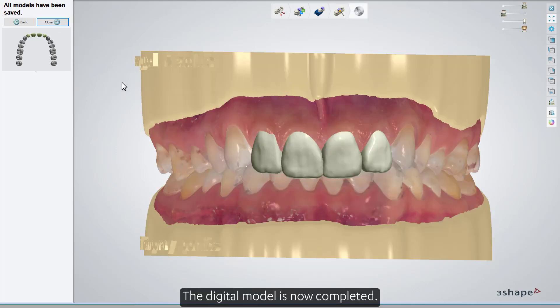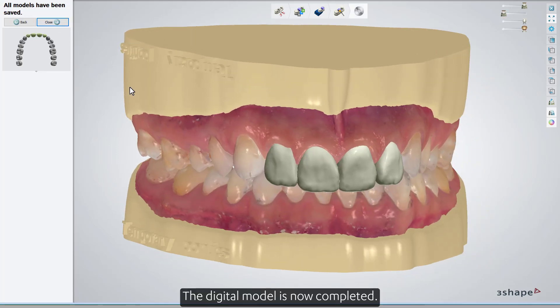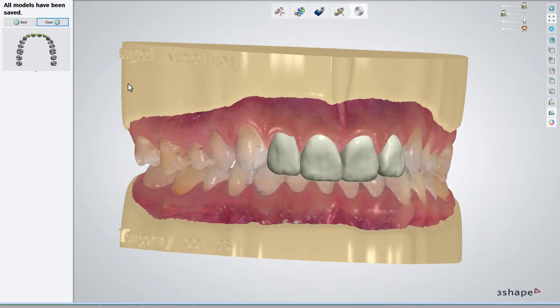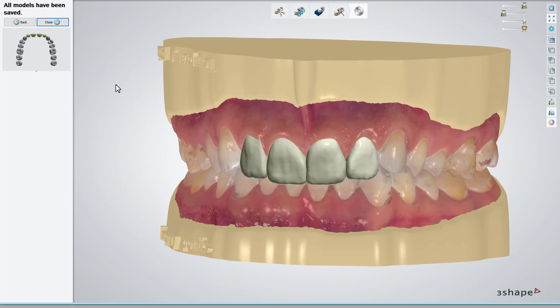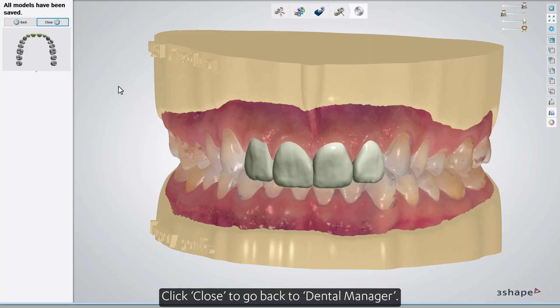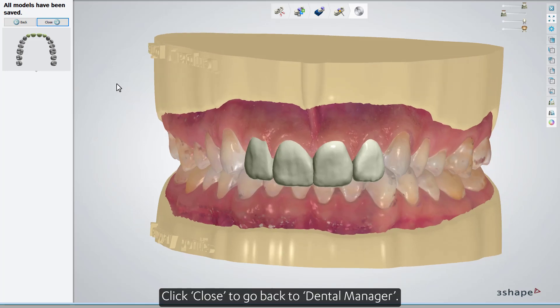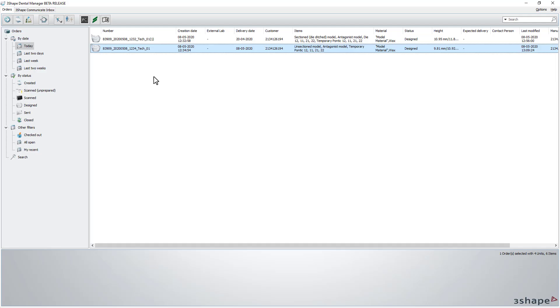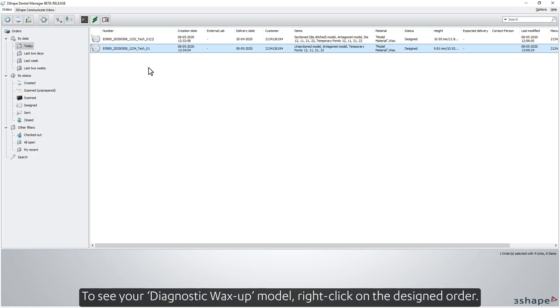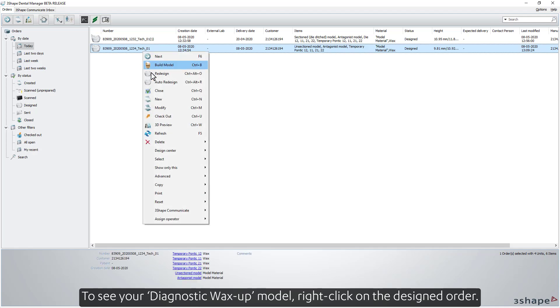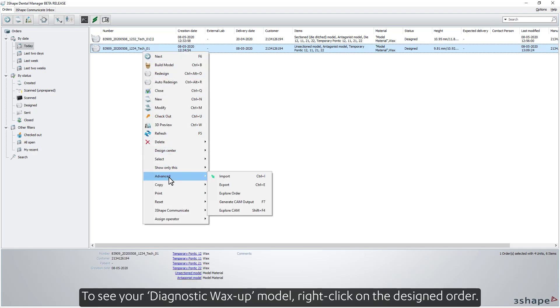The digital model is now completed. Click Close to go back to Dental Manager. To see your diagnostic wax-up model, right-click on the designed order.